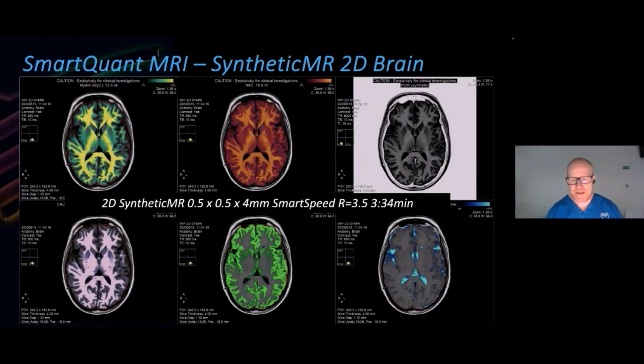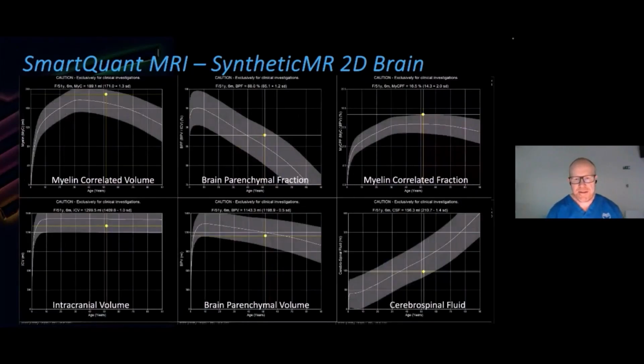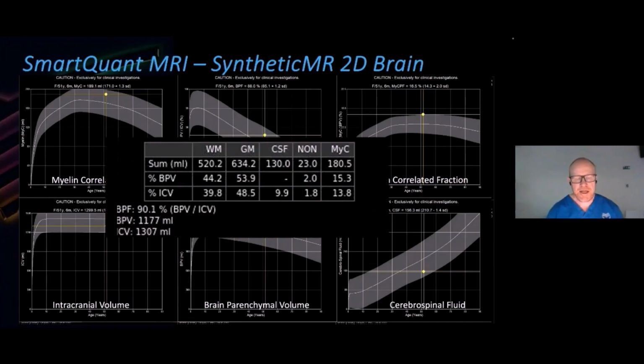So all of this is very important, and it takes the subjectivity out of reporting. It makes it very objective. Then you get these beautiful graphs, a bit like taking your child down to the doctor and having a look at their head circumference and how high they are. You can map these details against large population just to see early changes in all sorts of different types of disease or pathologies. Then you get quantitative data where you're getting real numbers. And this is something that's really important, especially for physicians, if you want to see something that's having trends of up or downwards.